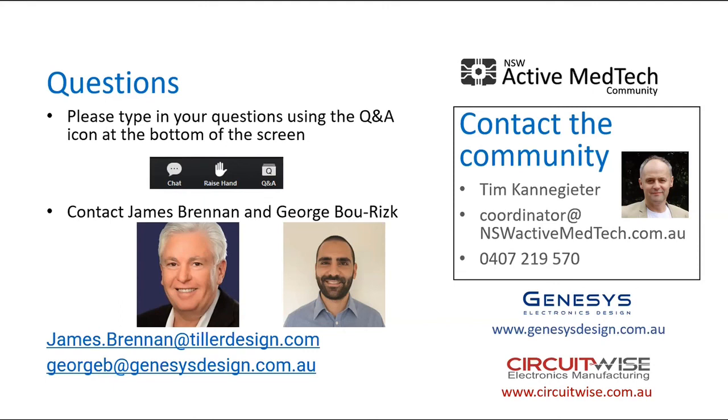Maybe that might be the example that James made with that particular patient that got overdosed. I'm not sure if in that specific situation the user interface was specific to the display. That's an example of where, if that display is not showing what it needs to show because of that additional risk or hazard that may have occurred by using SOUP, then that really can be a problematic situation.